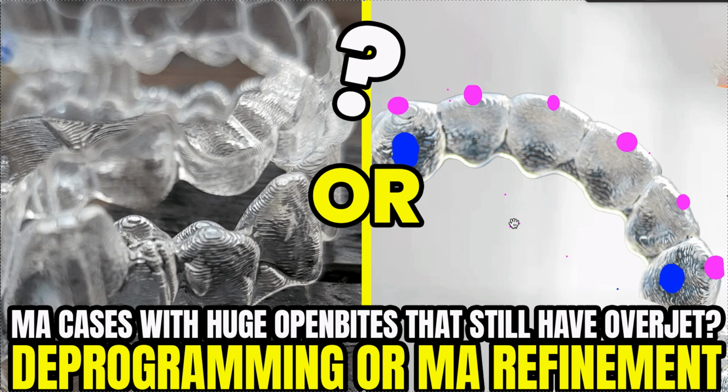Not a big deal. But the funny thing is that Align Technology tells you to keep going and do refinements, and they put these giant attachments on to extrude the teeth, and that is so inefficient. I don't understand why their ClinChecks do not represent what really happens. I think they need to make them realistic, because the first time you do an MA case, if you don't know what's going to happen, you're going to freak out, and the patient's going to freak out.